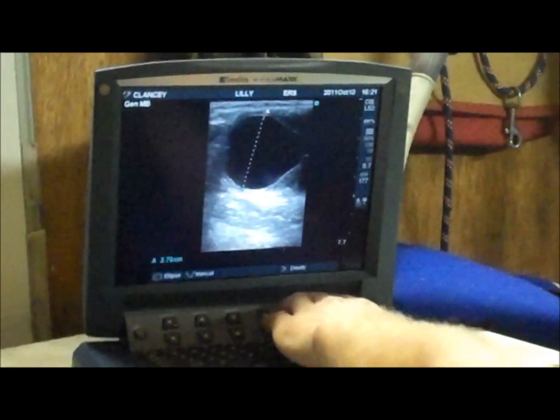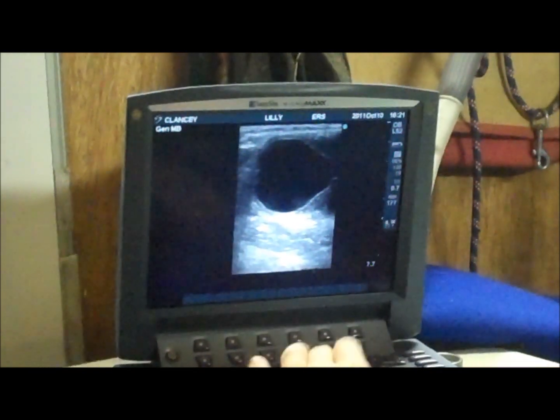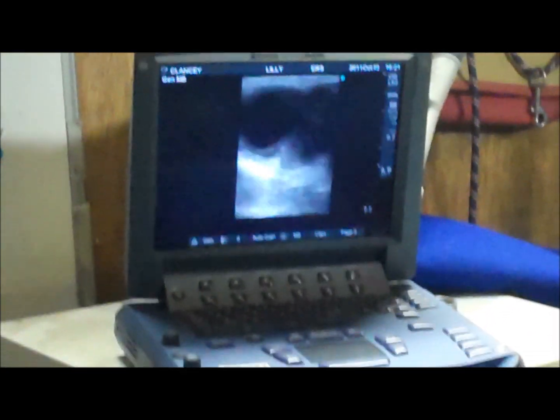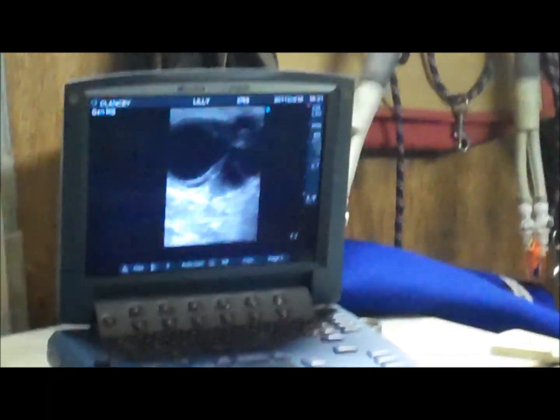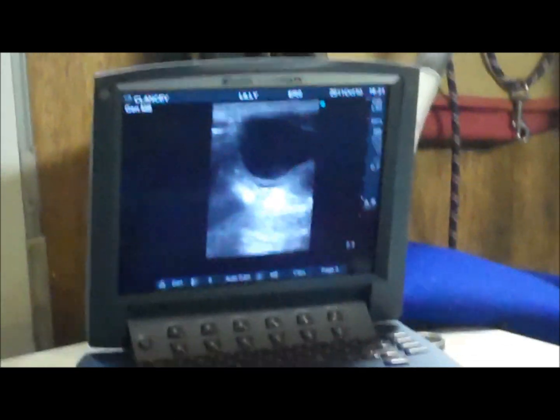38mm. Slightly softening, it's just starting to point in that region. Just go slightly obliquely — you can see the thickness of the wall. Slightly tender on palpation.